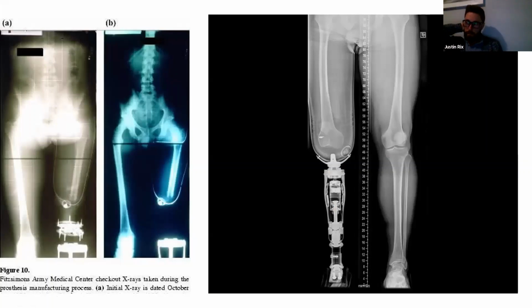We have plenty of space to work with to fit the components underneath. And it's a long enough lever arm to help power the prosthesis during the swing phase. The shorter the lever arm in a transfemoral amputee, or any amputation at least, it makes it more difficult to drive it forward. Then on the image on the left, we have a knee disarticulation.